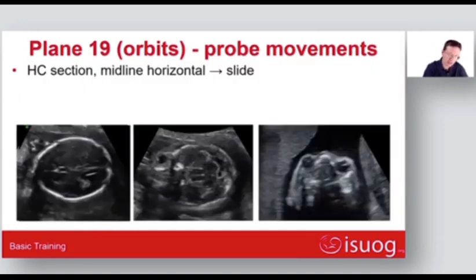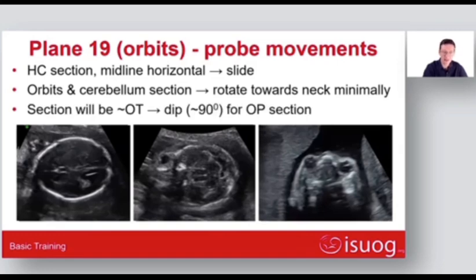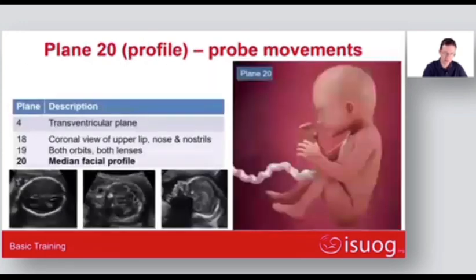First, the transventricular plane, then you slide down in parallel until you find the orbit, and you slide laterally in the same plane to face the orbits and the face. The presence of both orbits and normal position and separation of the eyes should be checked.